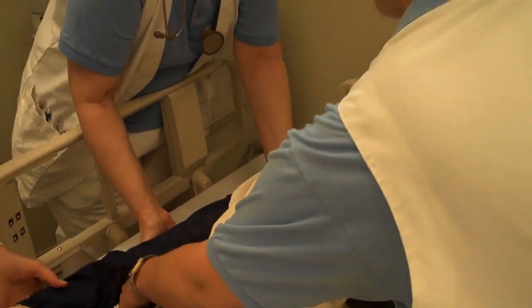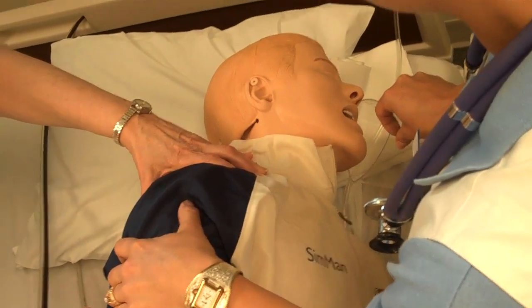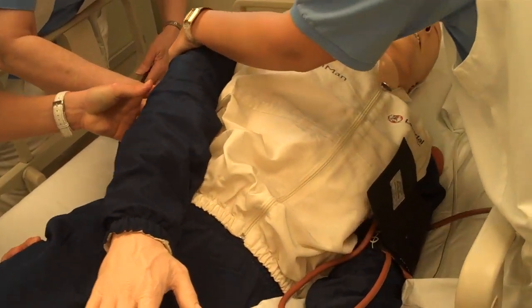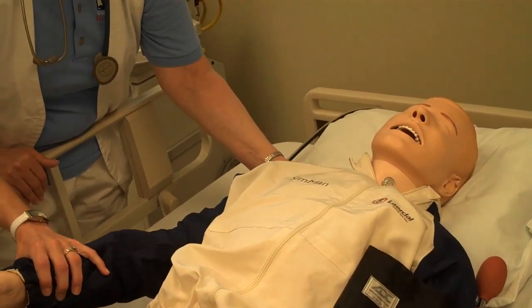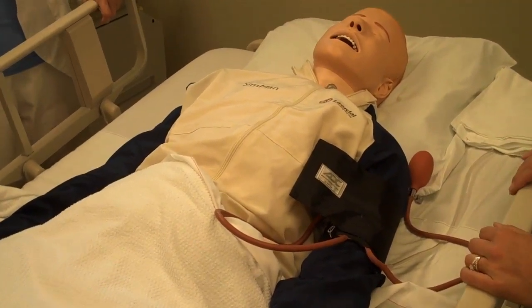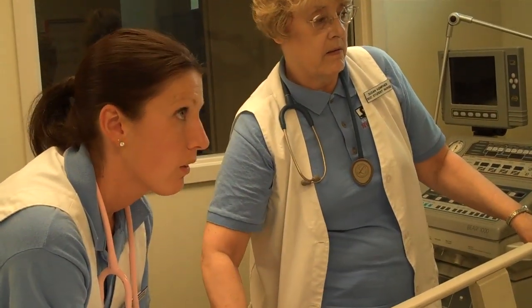'I'm so sick.' 'Do you think you're going to vomit?' 'Yeah.' 'Let's turn him to the side — we're going to put him to your side.' 'Okay, now lay back. Get you cleaned up here.' 'Would you like your head to be a little bit higher?' 'Yeah, I'm quite nauseous.' 'I'm going to get you something for that vomiting — give him an antiemetic.' 'I'm going to put it through your IV again.' 'I just took his temperature — it's 37.2.'